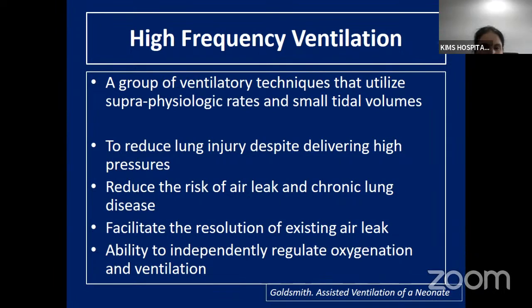So, for example, if you're using conventional ventilation at a peak pressure of 20 by PEEP of 6 and the baby develops CO2 retention with appropriate oxygenation, you may want to increase the peak pressure, the PIP, to around say 22 in an effort to improve CO2 elimination. But this change will also affect the mean airway pressure. Hence, you may also find an undesirable increase in oxygenation, which may not be wanted at that point of time.